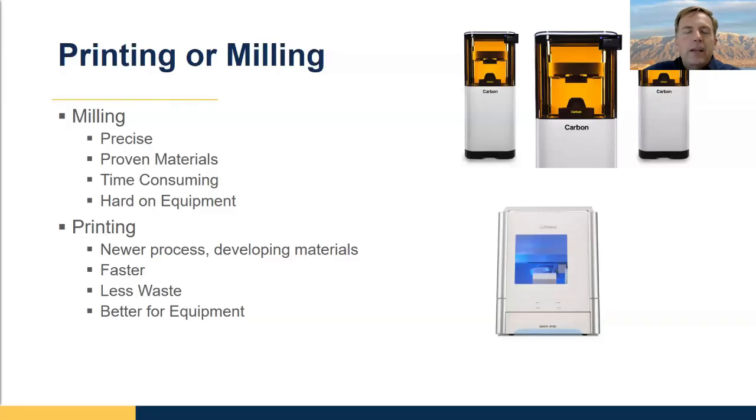Printing or milling, we've been talking about this quite a bit, so I'll go through it a little bit quicker. From a theoretic perspective, 3D printing is better than milling because when you're printing, you take a vat of liquid and you only polymerize the things that you need to create. So there's very little waste.